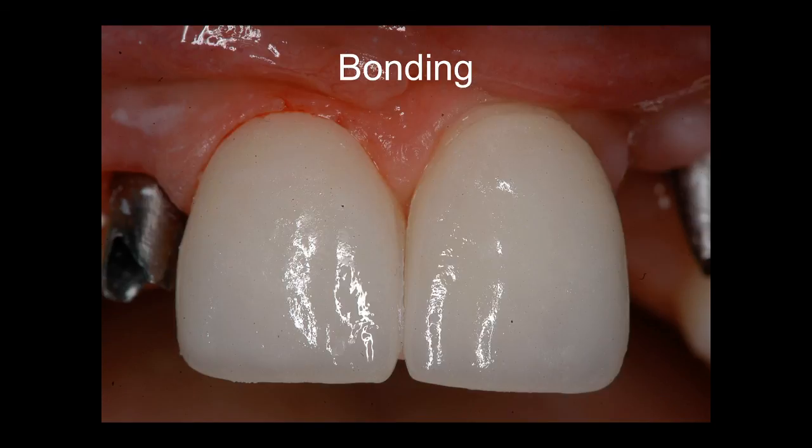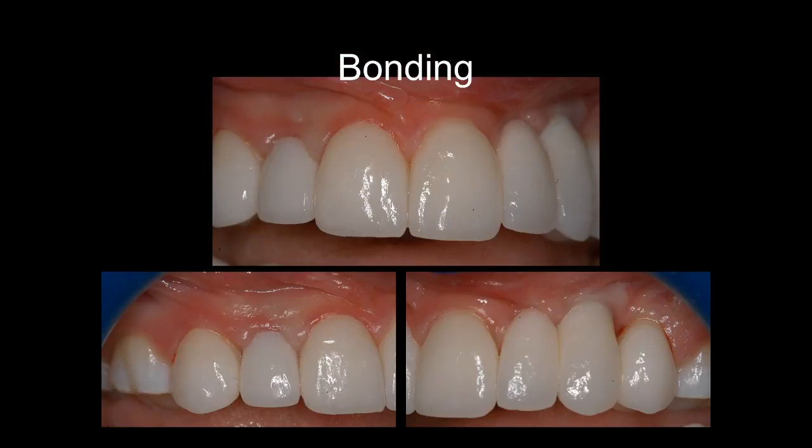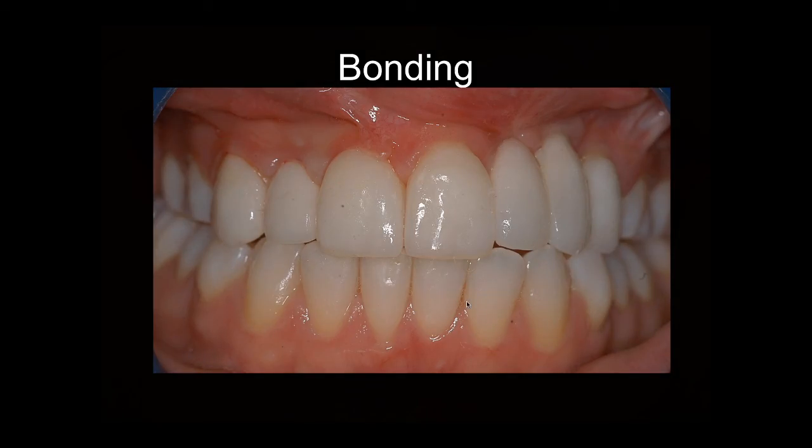As you can see, now we are removing the excess on the gingiva, because if we have bleeding, it will contaminate the site, and then we will have a complex situation. For that, now we will go and remove the cement on the number 21. And you can see how the whole thing was approached. As you can see, all the cement was removed. The margins are supragingival. This is the day of the cementation. And you can see her some time later, when the tissue integration was done.